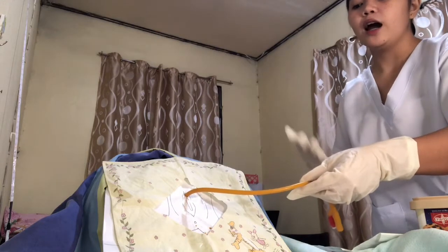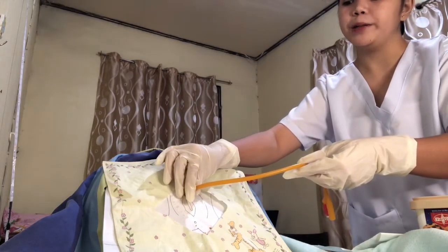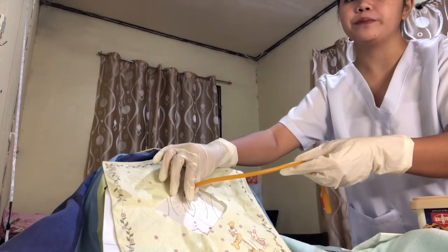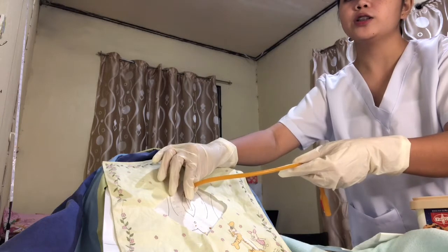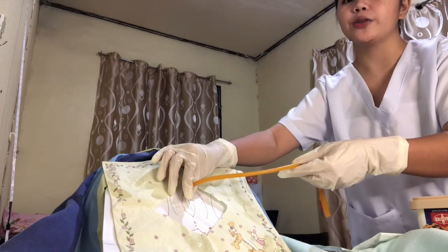So next is rest the hand on the pubis area while holding the catheter in place. So this is to prevent pulling and pushing of the catheter. Withdrawing the catheter and pushing it back into the urethra increases the possibility of contamination of the urethra.